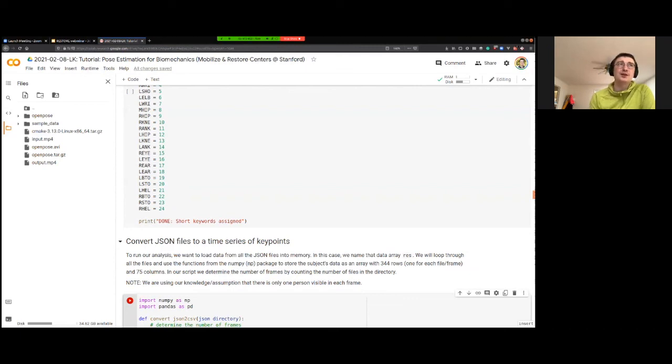So I think we are there or almost there on the technology side, but the question is how to actually make the user experience bearable and easy enough to make people commit to that.